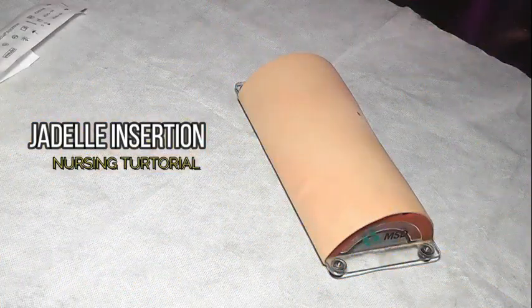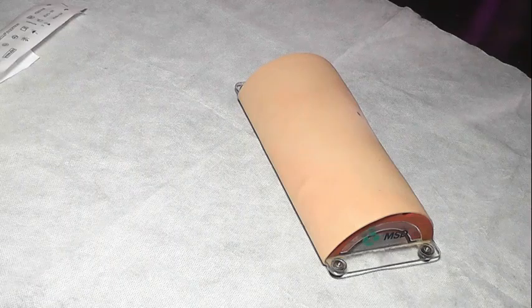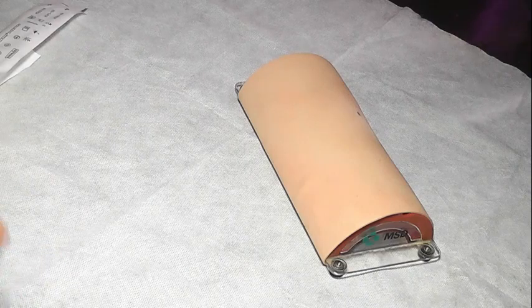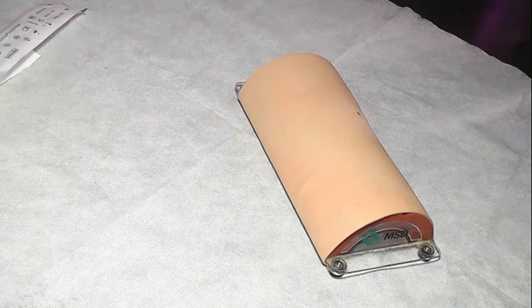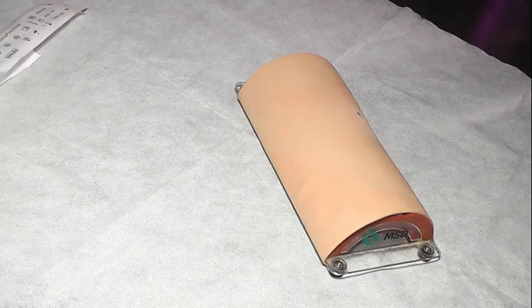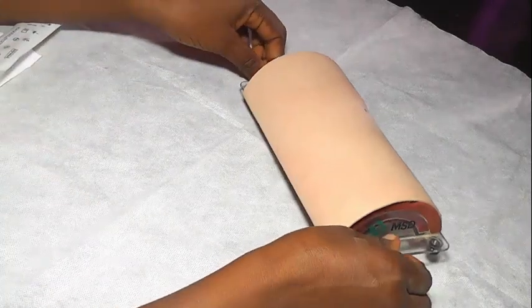So now in the insertion of Jadelle, it is usually done after the counseling section. So the first thing you're supposed to do is to make the client comfortable in a lying position. The client lies in a dorsal position, and then the arm for the insertion of the Jadelle is extended. So this is the arm that we're going to use.